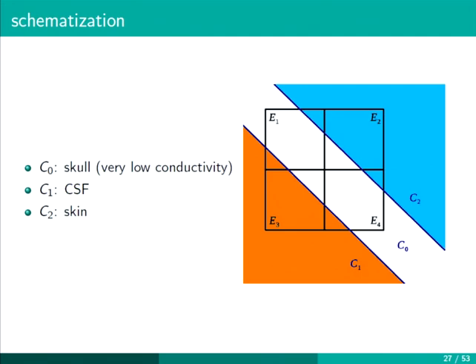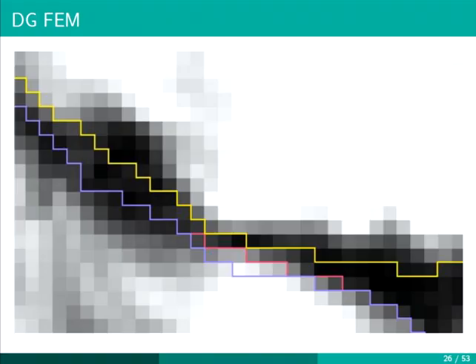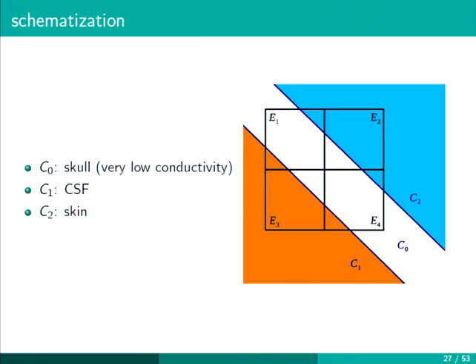So we would like to build a mesh with hexahedra, because then we have direct information from the MRI. Now, if we zoom again in on one of these cases, and this is depicted here, we have 3 compartments.